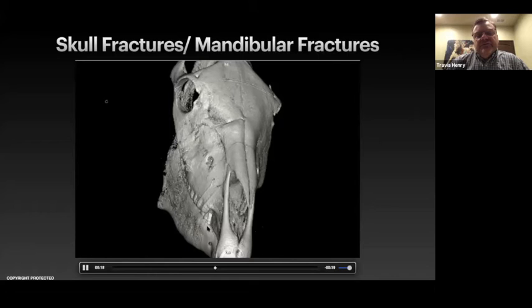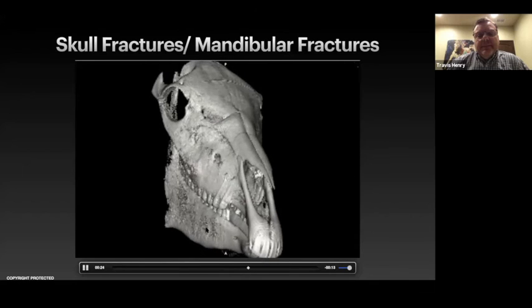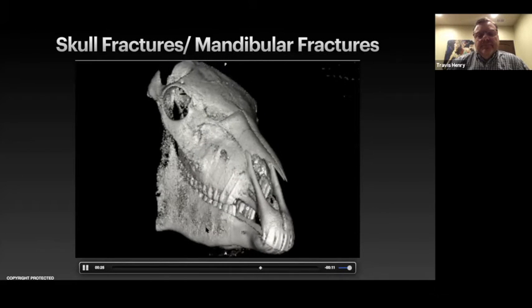So to just finish this out then, as we rotate and position this horse, we can see that nice sequestra laying right here. Also to note, young horses, we have to remember that the bone over these tooth roots or apex of these teeth is very thin. So it's no wonder that they get in scuffles and skirmishes and cause trouble with their teeth, because there's basically very little protection for them when they're young.